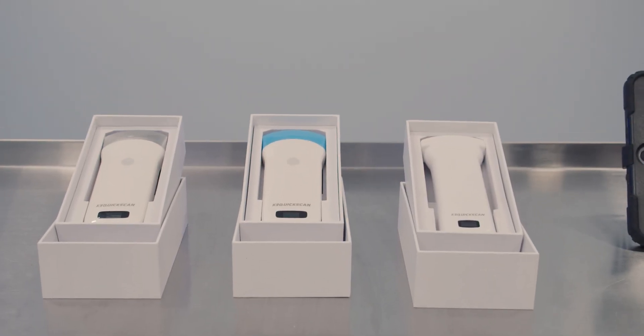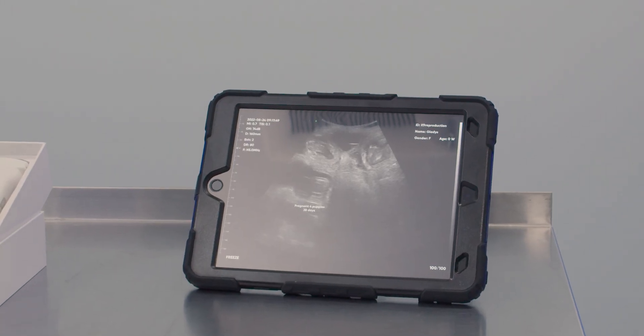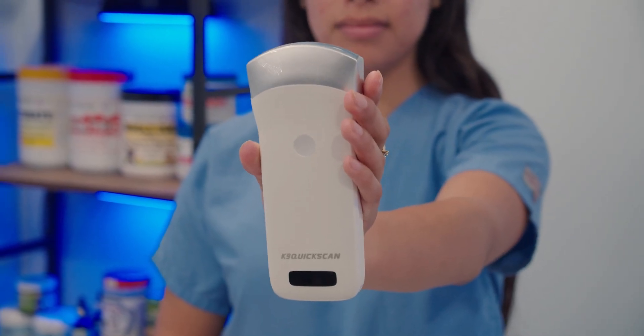These probes are iPhone and iPad compatible with an app easily found in the iOS App Store. Another great feature to note is you do not need access to the internet, which makes this a great setup for a reproduction technician on the go.